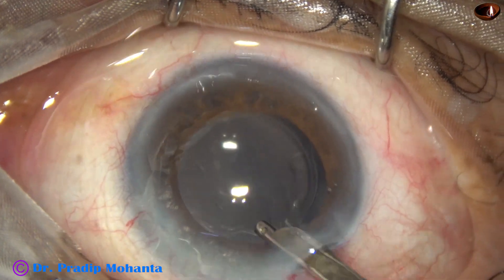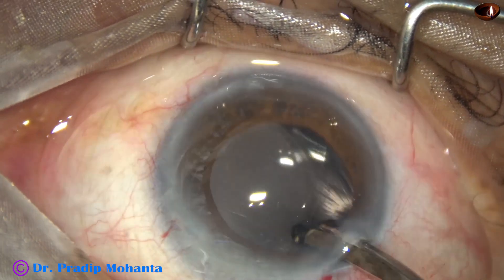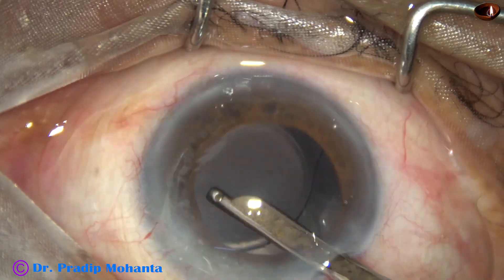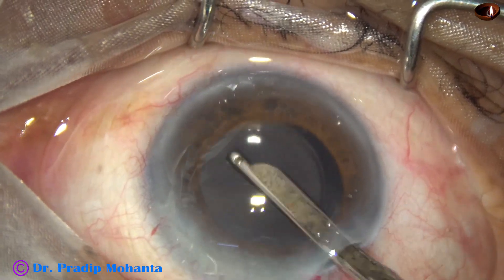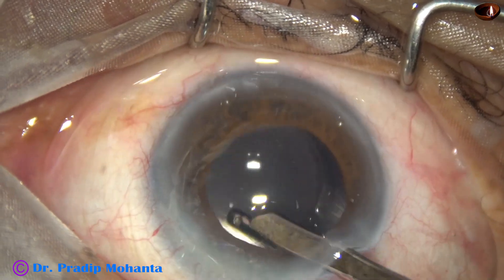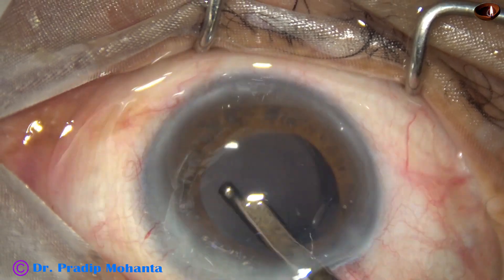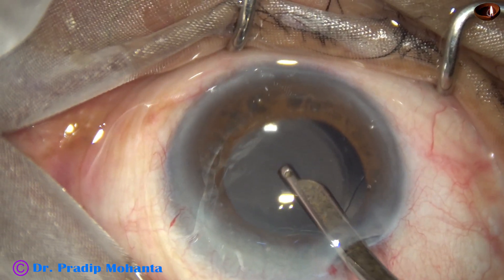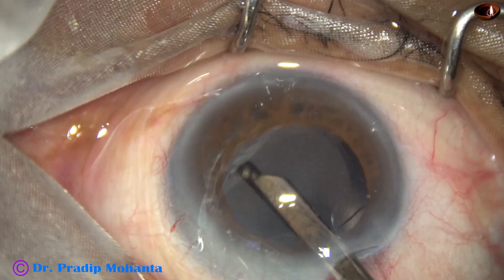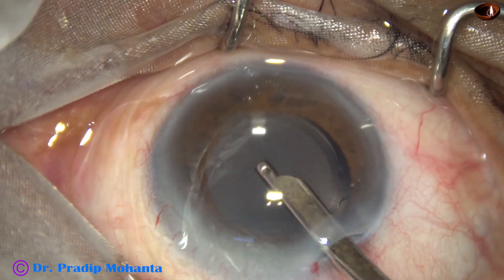The viscoelastic is now removed — first by Simcoe cannula, and then by bimanual irrigation-aspiration cannula. We must remove the viscoelastic very thoroughly and meticulously in all cases, giving quality time to this step, because intraocular pressure will be raised if it is not removed properly.